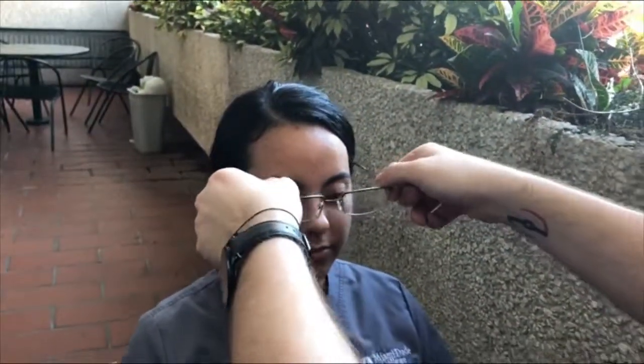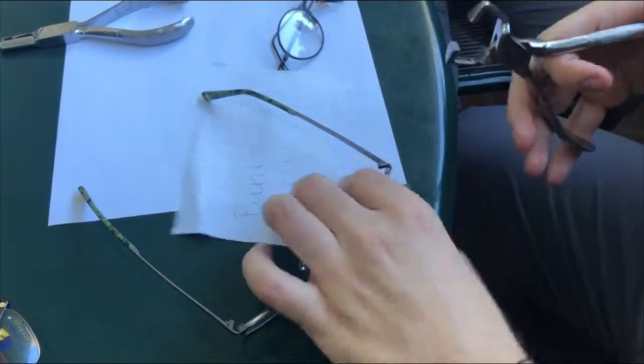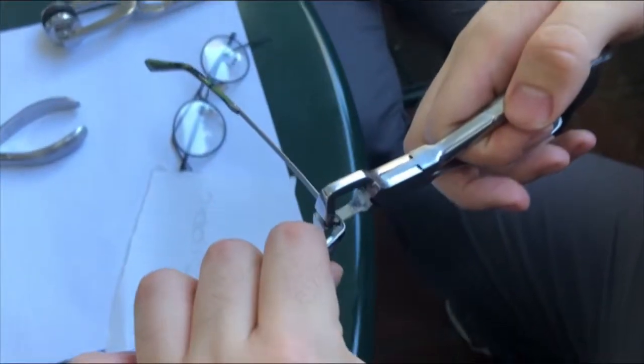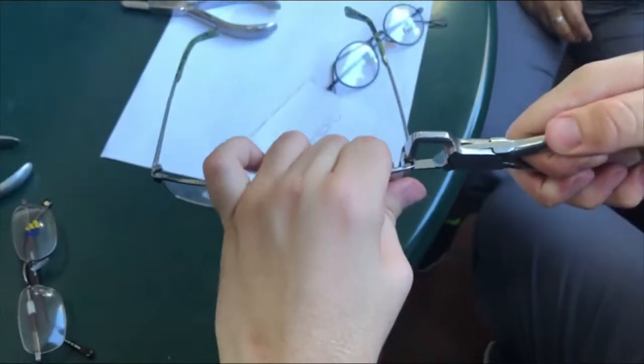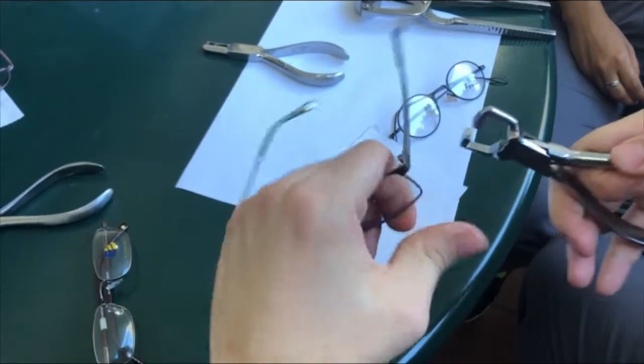In order to correct this, what you're going to do, you're going to grab your wide jaw angling plier and you're going to raise the end pieces in order to reduce the panoscopic tilt.